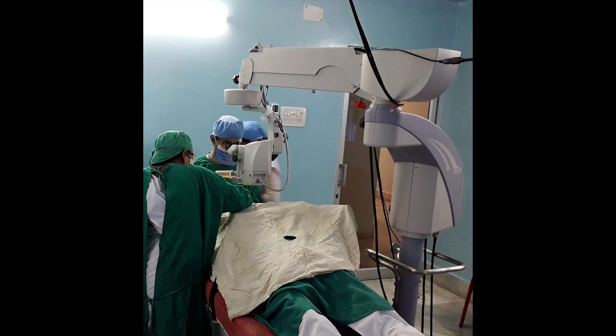Lumera Eye of Zeiss and Leica M822 are also very good microscopes, no doubt about it. But if you are financially stressed and if you want to save 10 to 15 lakhs, you can definitely go for this microscope.